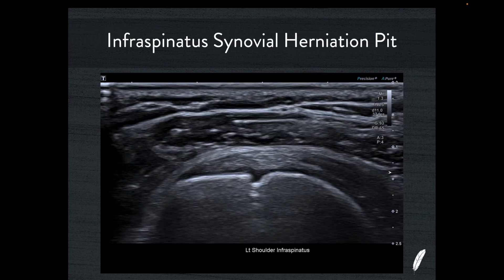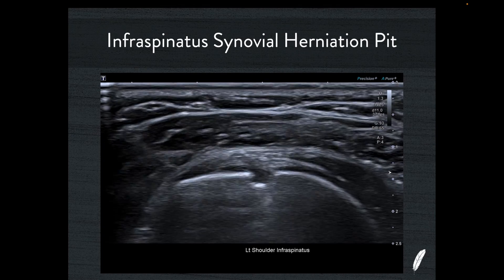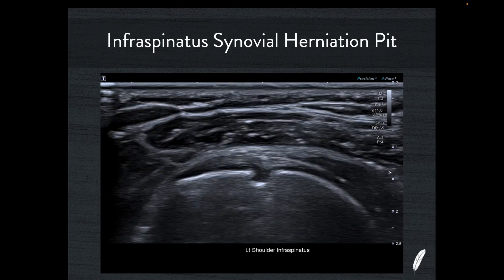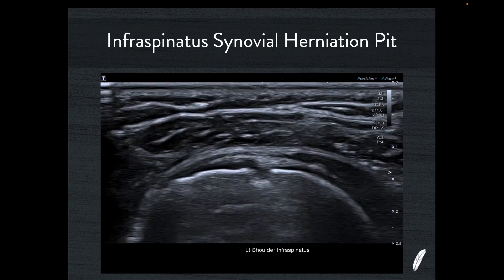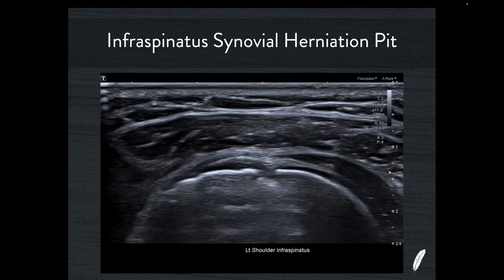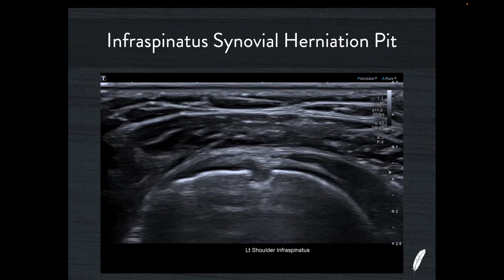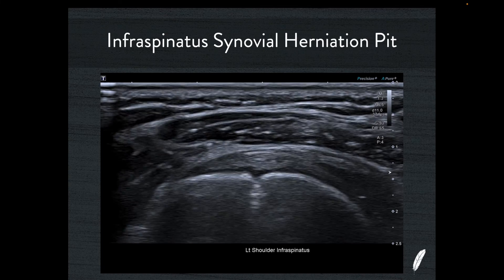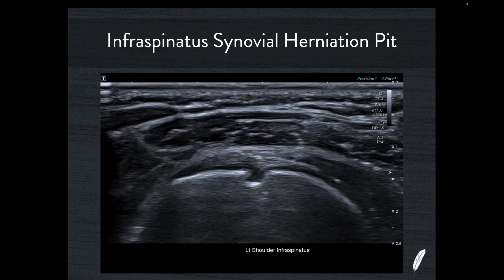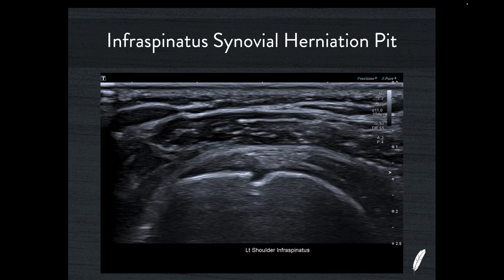Another really common location is infraspinatus. You'll see these day in, day out — in the same classic location — and the collagen adjacent to the little synovial herniation pit is perfectly healthy. One tricky thing with infraspinatus synovial herniation pits is their proximity to where you may expect to see a Hill-Sachs deformity. These synovial herniation pits in this location can be quite broad and quite deep. So if a patient has had a dislocation and I'm thinking about a Hill-Sachs deformity, I'll be quite cautious about this bony architecture — the defect I'm seeing in the bone, given the history, may in fact be a little Hill-Sachs deformity, a little fracture in the posterior humeral head. However, a synovial herniation pit is another differential diagnosis.